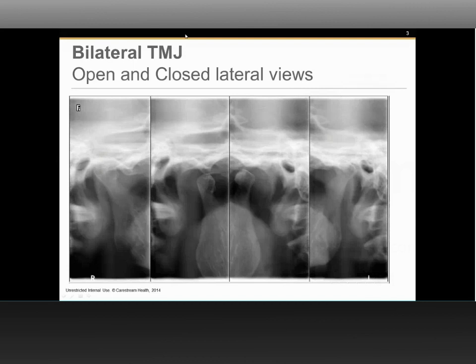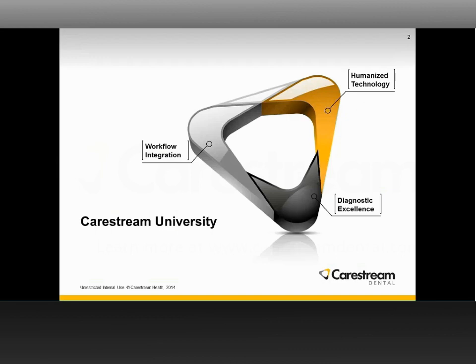So what are the indications for use of CBCT imaging in visualizing the TMJ? Well, it is very simple. As I've noted before, CBCTs can be used for or are applicable in any kind of hard tissue imaging. So anytime a clinician suspects some sort of osteoarthritic changes or any change in hard tissues, if you suspect that there could be possible changes in the hard tissues of the TMJ apparatus, a CBCT scan is very well warranted.